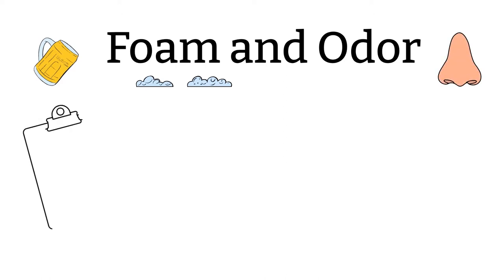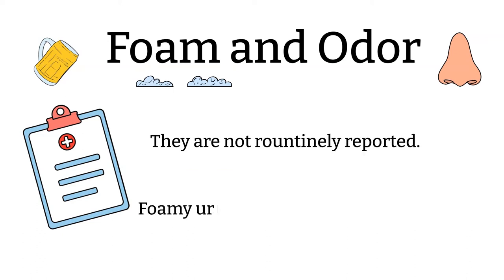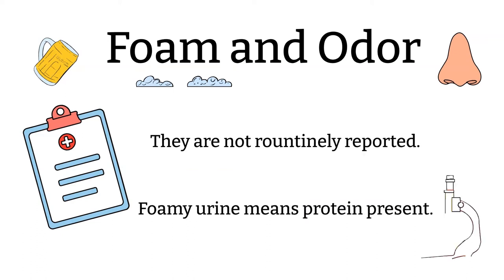Foam and odor. Foam and odor are not routinely reported as a part of urine analysis, but when a CLS notices anything significant, we'll make a note about it. Foamy urine suggests that the urine has protein present, which can be confirmed with the chemical part of urine analysis.